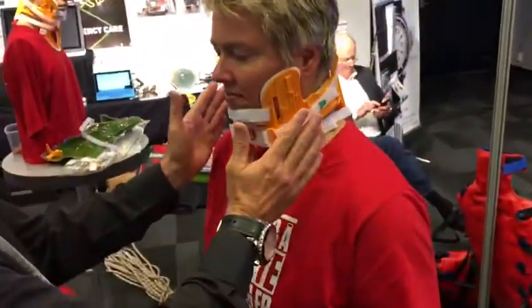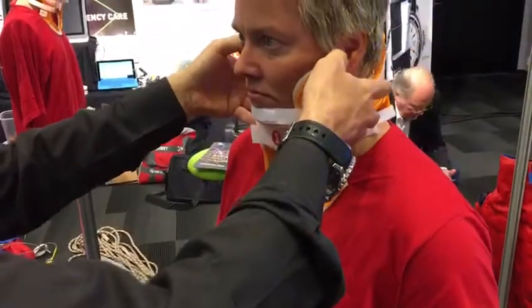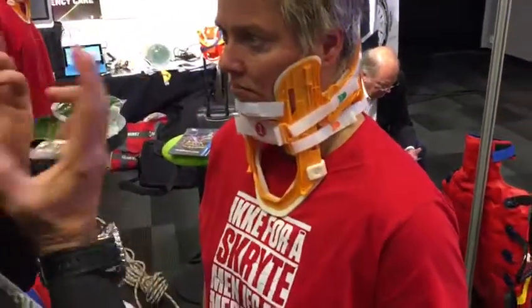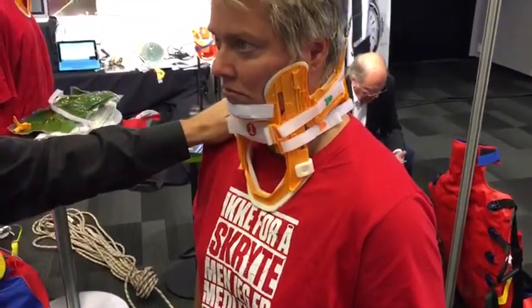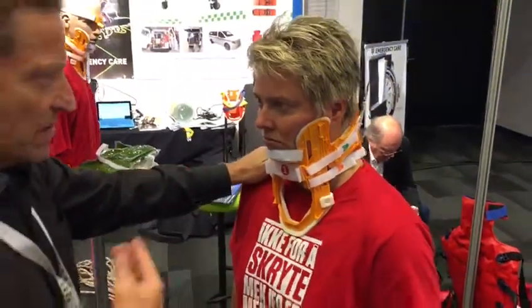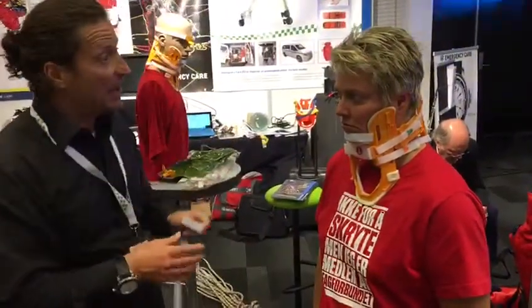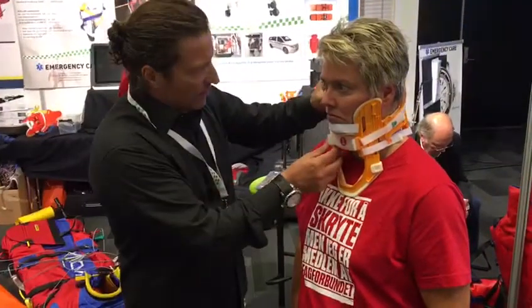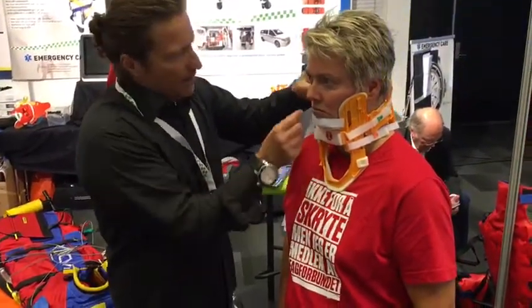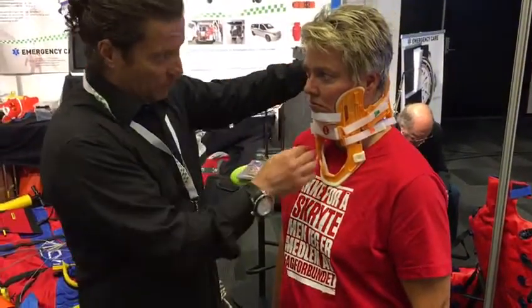We have some flexibility here for different face shapes. If you find a patient on the scene with paralysis or some type of neurological deficit, we want to achieve the highest level of immobilization. For that, we're going to use an additional strap. This is only needed for critical patients, so it's a small percentage.